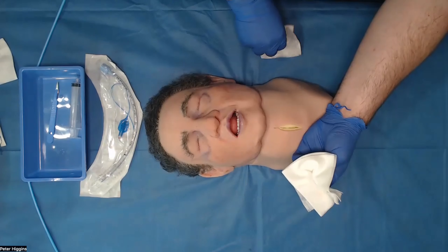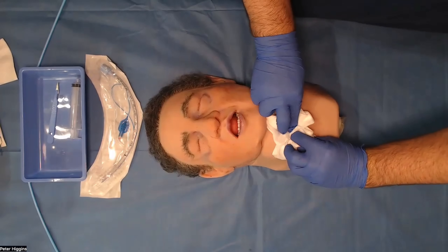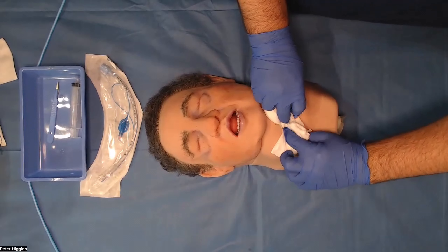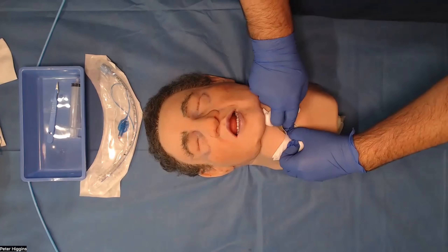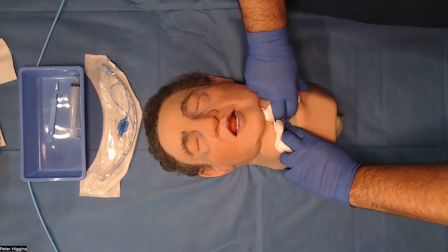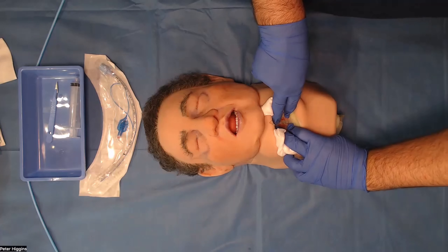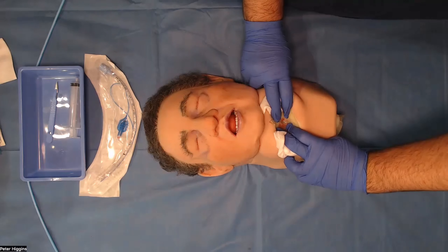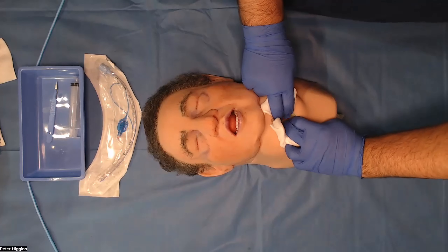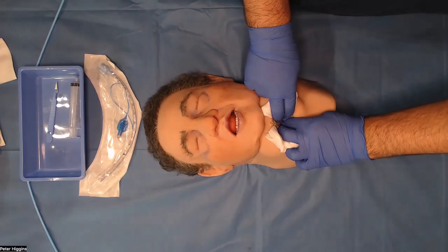I'm going to incise my way through that top layer of fat there. Now I'm going to take my swabs and blunt dissect my way using my fingers to try and find this patient's trachea. As you can see here, just pulling the fat apart using swabs and fingers. There are your strap muscles just through that layer of fat. I've managed to burst my way through and found the trachea just there.